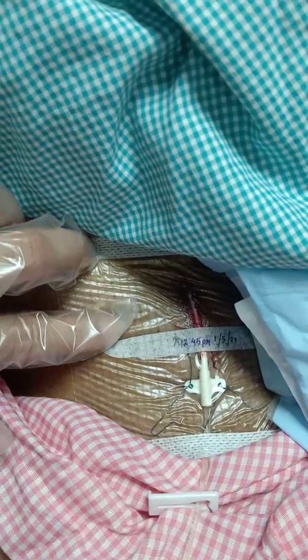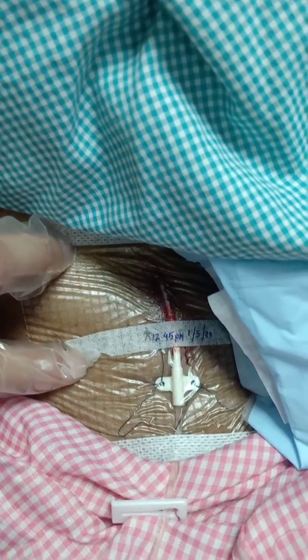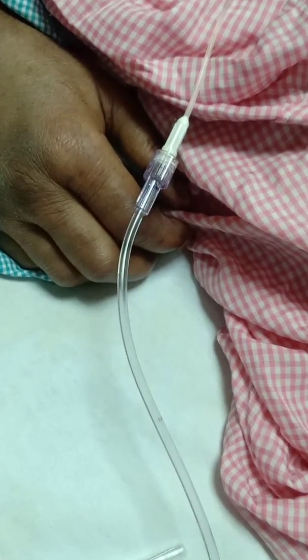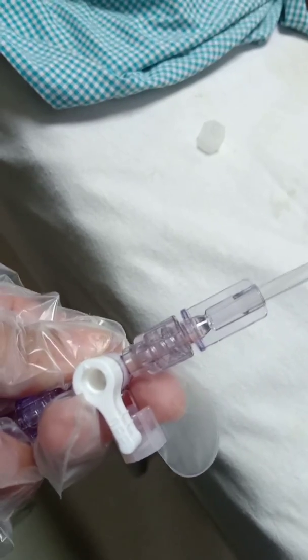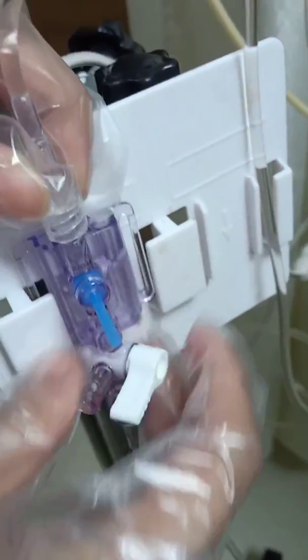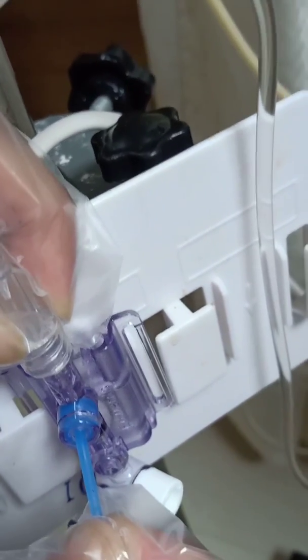Here we would like to show you an arterial line setup. This is an arterial catheter which has been placed in the femoral artery, and the end of the catheter at this hub is connected to the transducer set. Moving further, we can see a port with a three-way valve, which can be used for sample collection and also during zeroing. There is another port with a three-way valve, and then there is a transducer with a blue rubber which can be pulled for flushing.